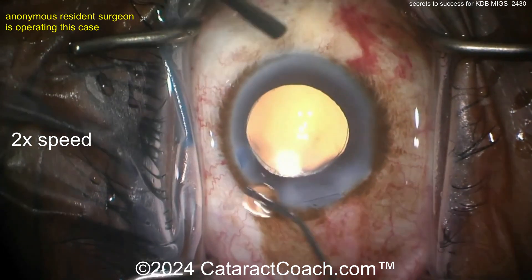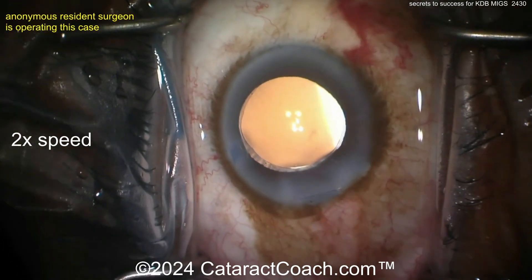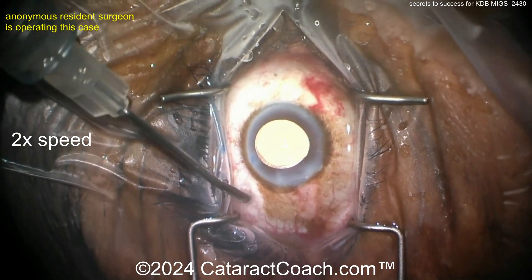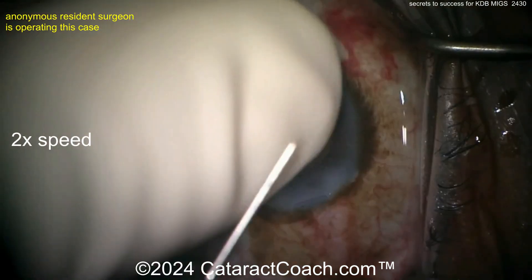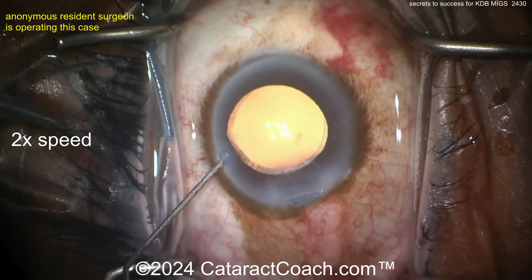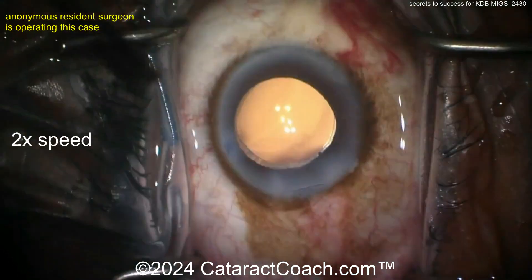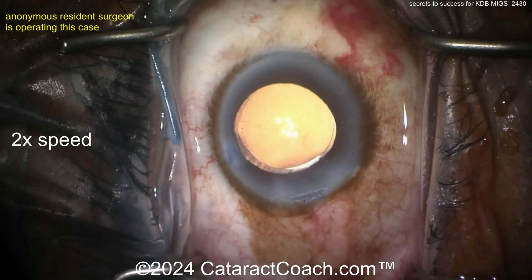Lightly seal up the main incision and check at the end. Look at the blanching there nasally — there's quite pronounced blanching in the area of the KDB treatment, which is really cool to see. Check the pressure at the end to make sure it's all reasonable. The patient will have a very nice outcome. This is part of our secrets series — committed to teaching you all the secrets you need to know about cataract surgery.